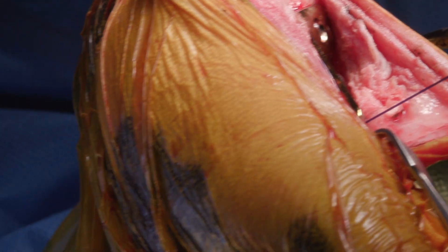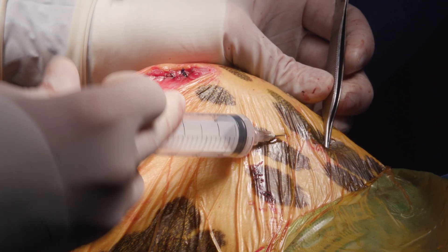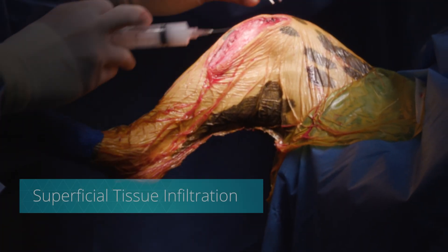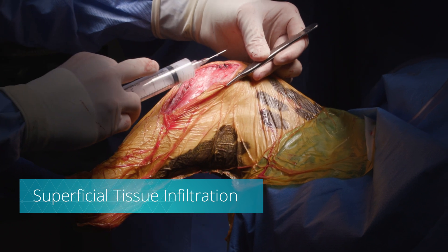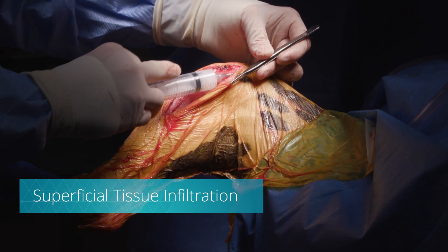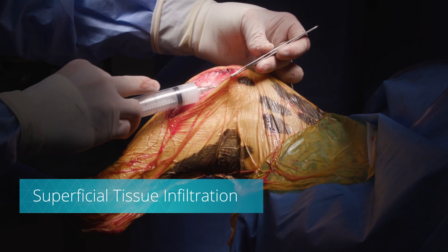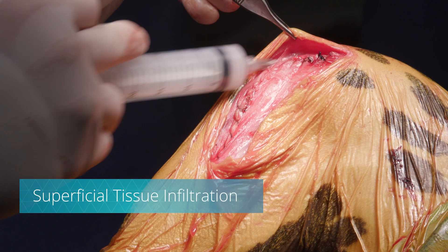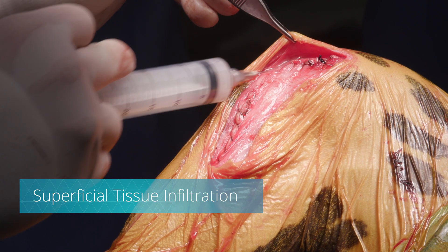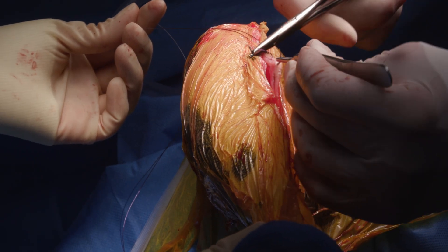Then the deep fascia is closed. If arthroscopy was used, infiltrate around the scope and egress portals. Next, using the moving needle infiltration technique, inject Nesita into the subcutaneous tissue surrounding the incision. Be sure to cover both sides of the incision as well as the proximal and distal ends. Finally, if any Nesita is left over, the remainder of the dose may be injected around the plate. And now the incision can be closed.